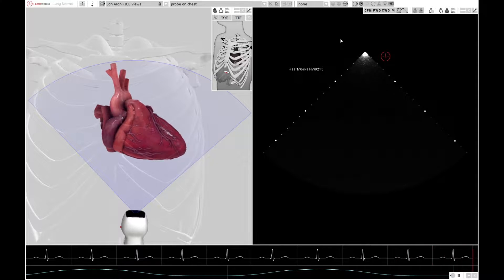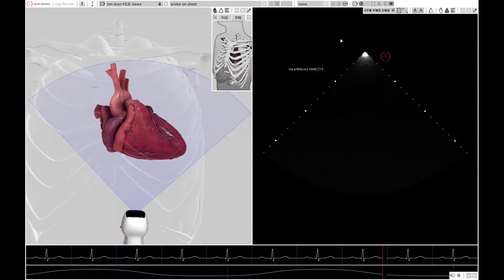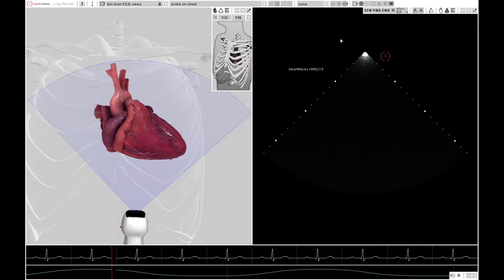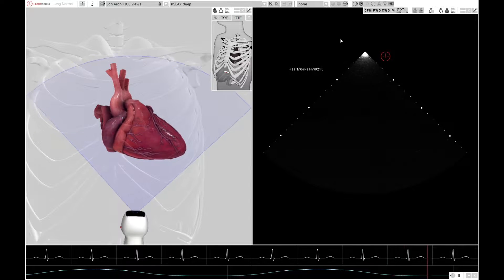Hello there, and welcome to our short video on how to acquire the Focused Intensive Care ECHO, or FICE views, that are required for this accreditation. There are a few extra views in there as well, which may be for your own learning benefit. Thank you very much to HeartWorks for allowing us to use their kit in producing this video.